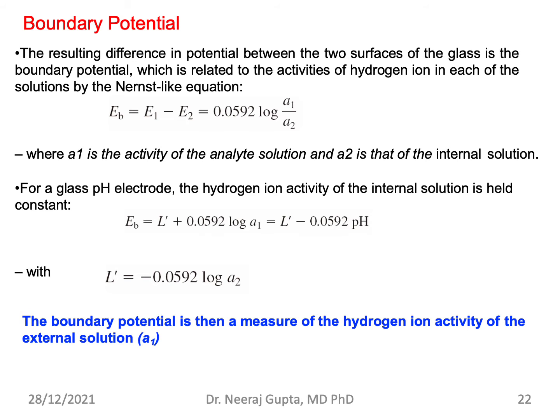You don't have to go into all these deep calculations, but you need to know the concept of how the pH is being calculated. So in the next slide, you will be seeing a small video on the glass pH electrode in a little bit more detail.